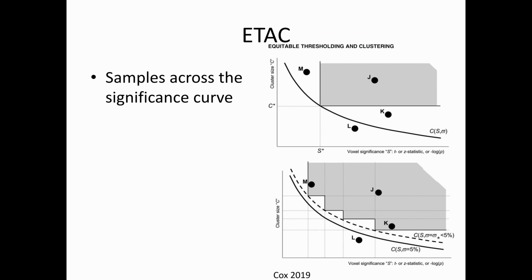Yeah, this all seems to be considering p-values. What about effect sizes as your dependent variable? Right, and I don't know if AFNI takes that into consideration or makes it easy to produce effect size maps. Post hoc, yeah, from a t-stat, from z, t, or F values. Yeah, it's a little harder going from LMEs, right? Because there's no direct translation, so you have to hack it a little bit.